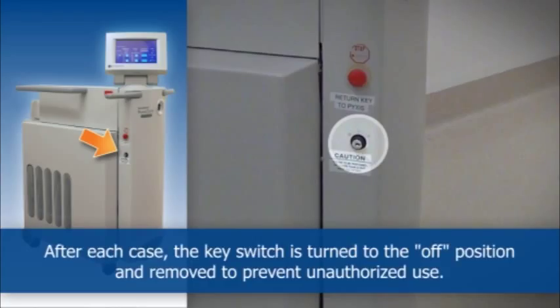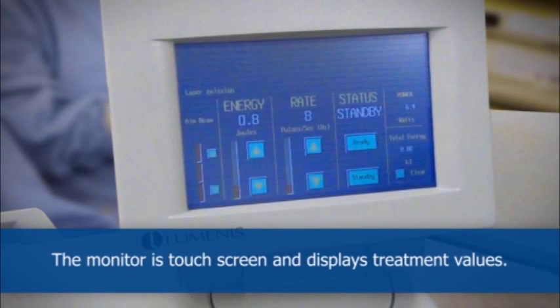After each case, the key switch is turned to the off position and removed to prevent unauthorized use. The monitor is touch screen and displays treatment values.